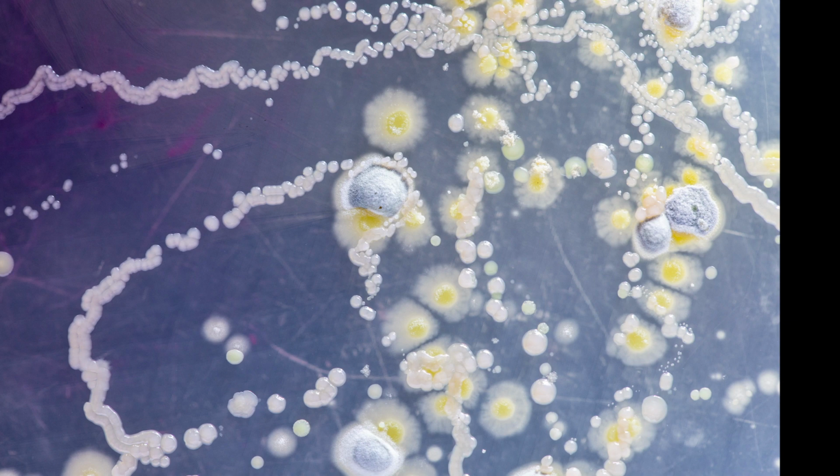If you have an E. coli with an ESBL, for example, and that strain has colonies within the cefotaxime or ceftazidime zone, that's also a good example to remind people that those colonies should be taken into account and not ignored when reading zones.